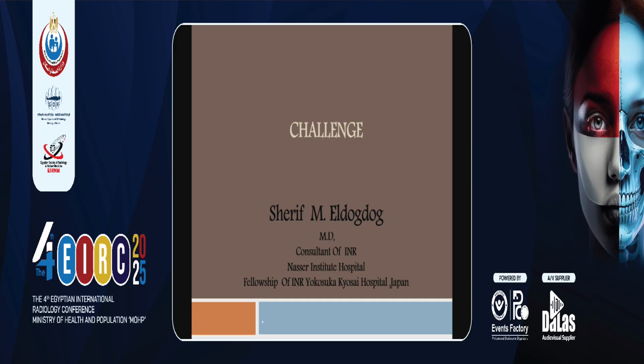You can do it simply from the start. Simple coiling will be enough for this aneurysm. If you do follow-up and you find recanalization, you can do something like a braided stent or flow diverter. But in this aneurysm, it's better, especially as we are in a poor country. Flow diverter is a high-cost procedure.